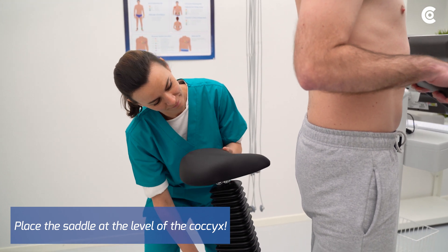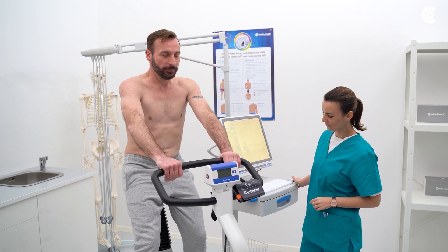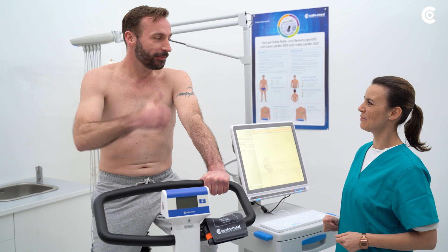Adjust the ergometer according to the patient's height and ask him to sit down. The hollows of the knees should always be slightly bent. Make sure that the patient feels comfortable.